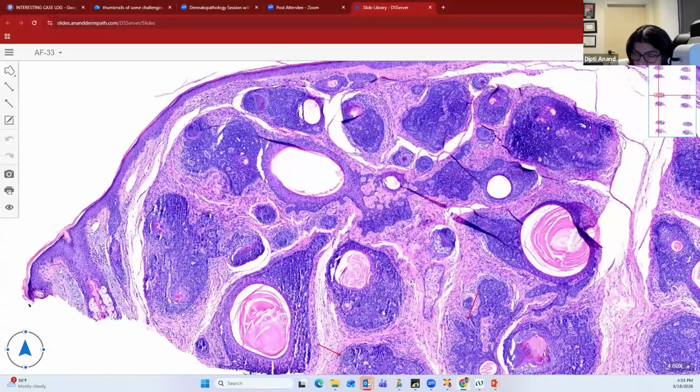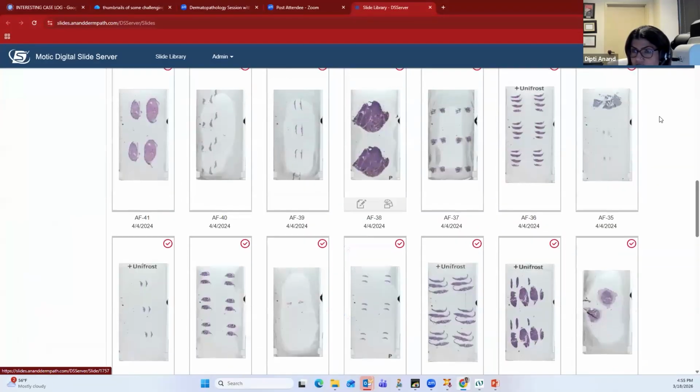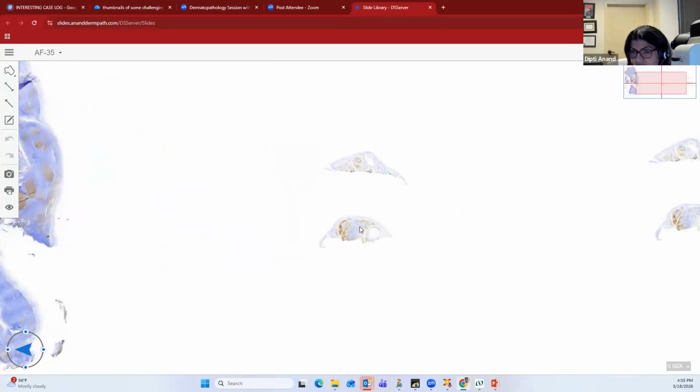Interestingly, the stroma in a trichoepithelioma will stain strongly with CD10. Now, I don't like to use a lot of markers in your adnexal tumors. Immunohistochemistry is not typically useful, but in a scenario like this, it is useful. In superficial shave biopsies, when you're trying to decide whether this is a benign follicular tumor or something like a basal cell, then stains, especially CD10, can be helpful.